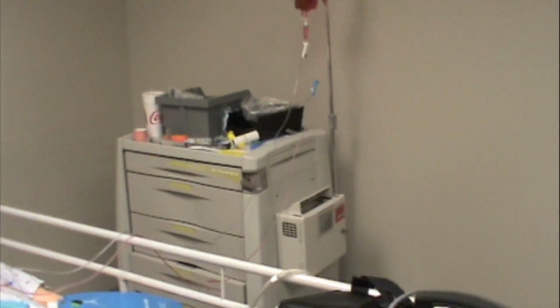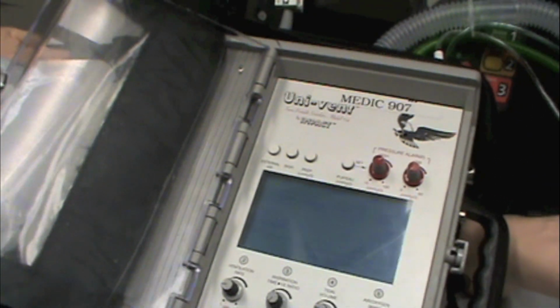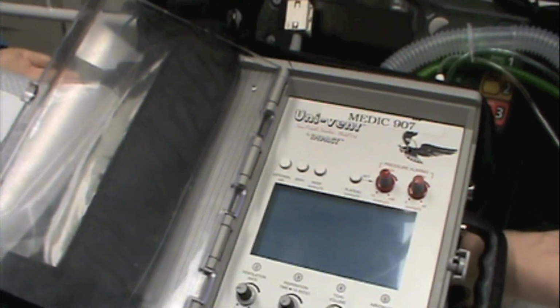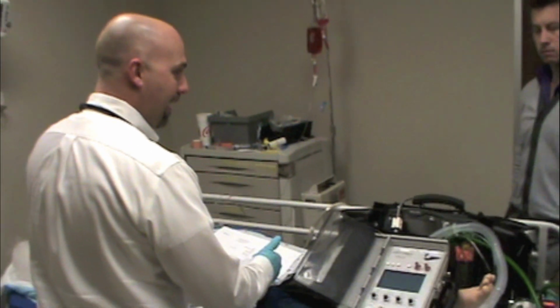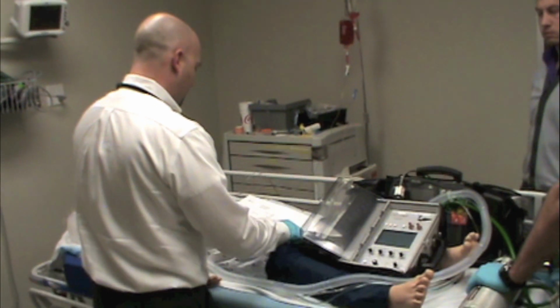So let's see, we talked about high PEEP causing problems for the patient's hemodynamics. We can crash their blood pressure if they have too much PEEP. We also set them up for lung injury if their PEEP is too high, and we also set them up for pneumothorax if they can't regulate that pressure in their chest on their own.